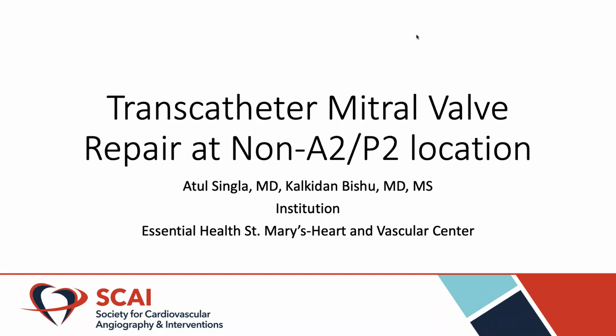Today I have a case of a transcatheter mitral valve repair at non-A2P2 location prepared by Dr. Atul Singhal and myself from our institution.